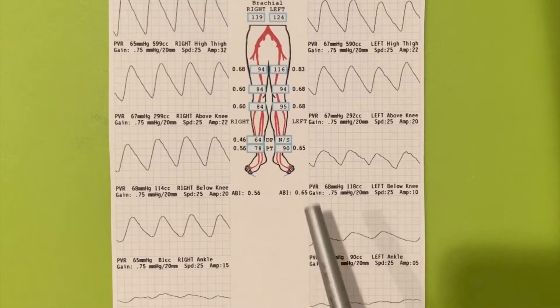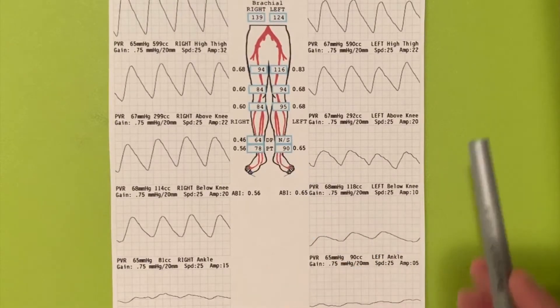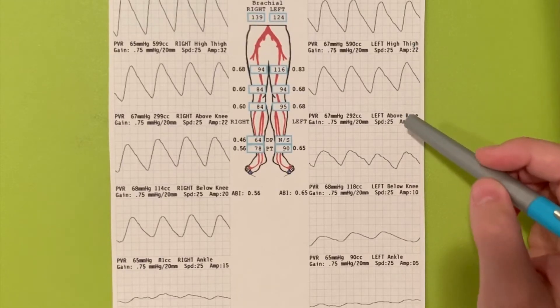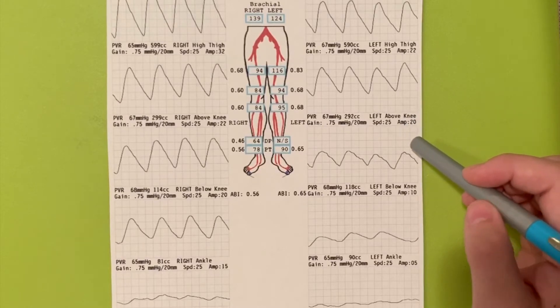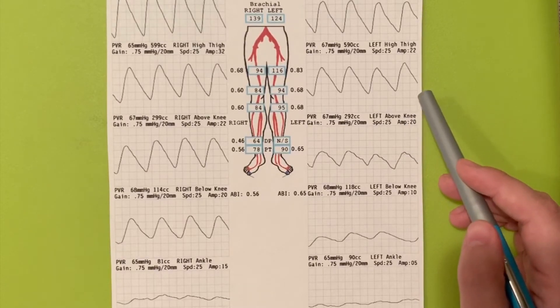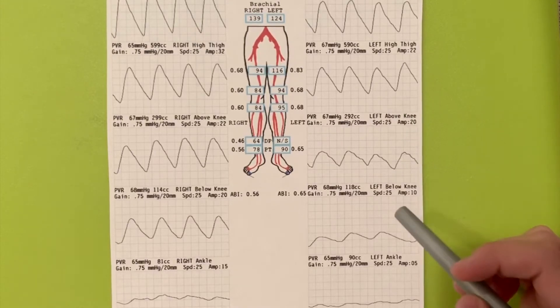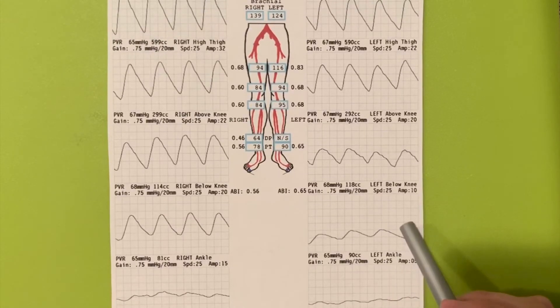There was no signal in the left dorsalis pedis artery. The PVR waveforms show significant deterioration of the left calf, which indicates superficial femoral artery occlusive disease. As you can see, the above the knee shows mild disease, the below the knee shows moderate disease, and the ankle and metatarsals show severe disease. The left ankle and metatarsal PVRs are blunted, consistent with significant occlusive disease.